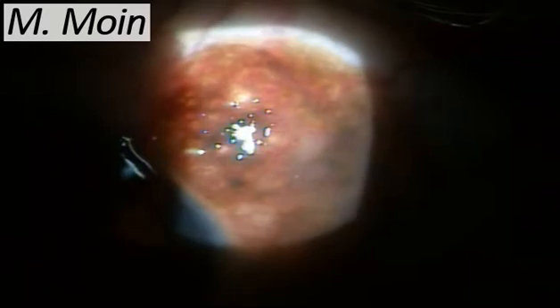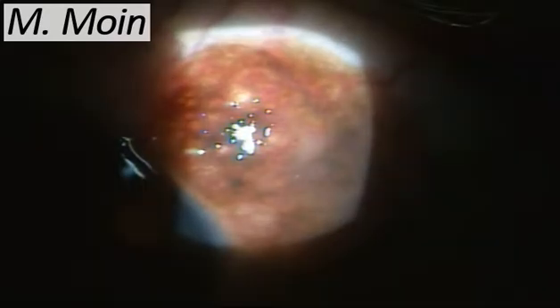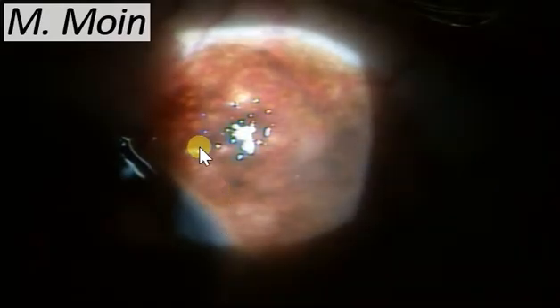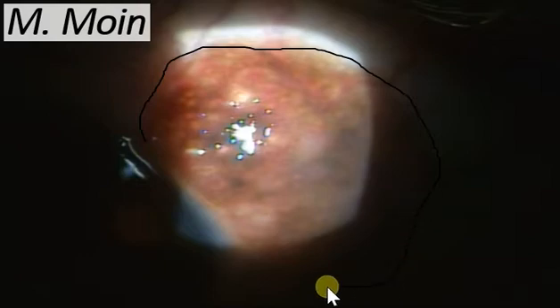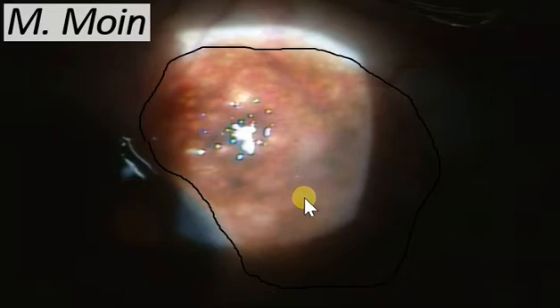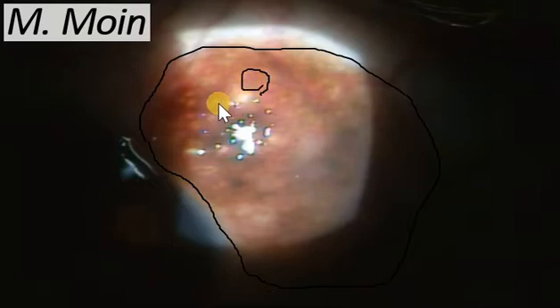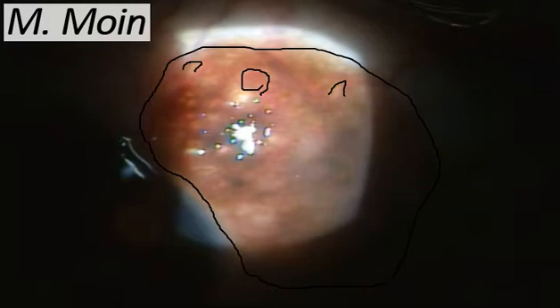Welcome to this video on slit lamp examination. Today we are going to show you a lesion of the conjunctiva. You can see this pigmented lesion present at the limbus. It is not markedly elevated, and there are some clear cystic spaces present within this lesion.